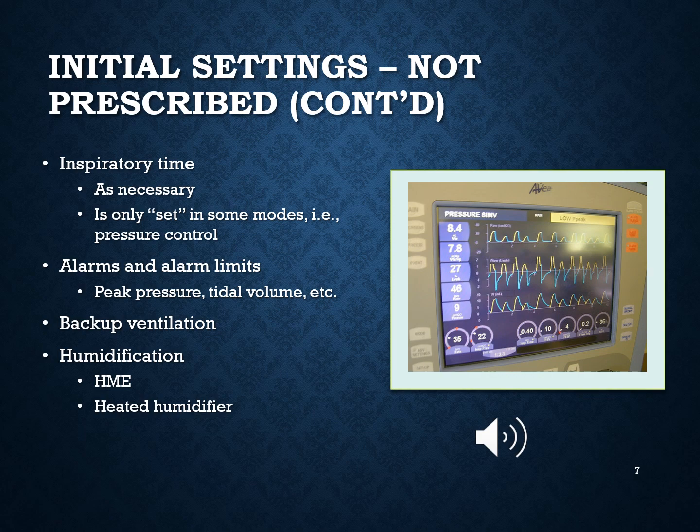Now, if you had all your alarms set and you have the patient on a CPAP mode and they went apneic for more than 20 seconds, then that ventilator is going to turn back into the previous setting. It's going to jump in and work for the patient, do the breathing for the patient at a rate of 10, a tidal volume of 500, PEEP of 5, 30%. It's going to kick in and take over. That is the backup ventilation.